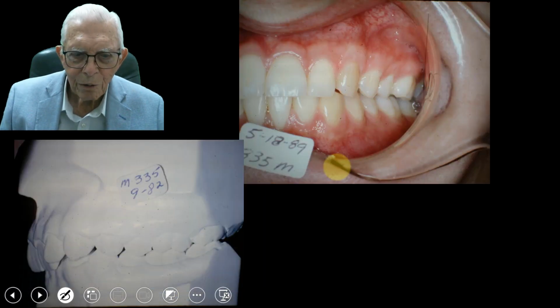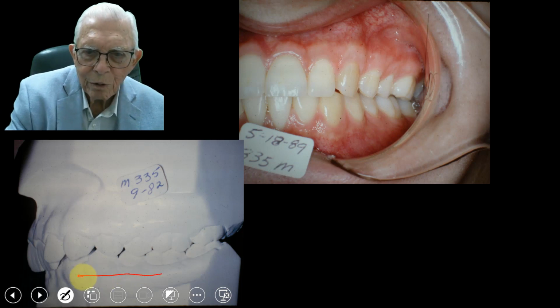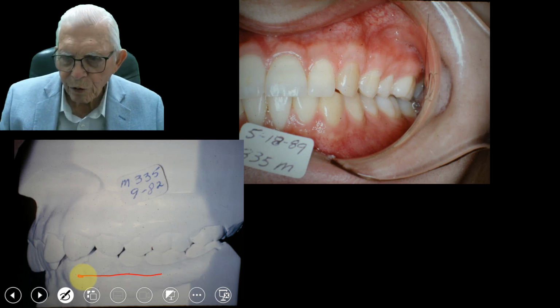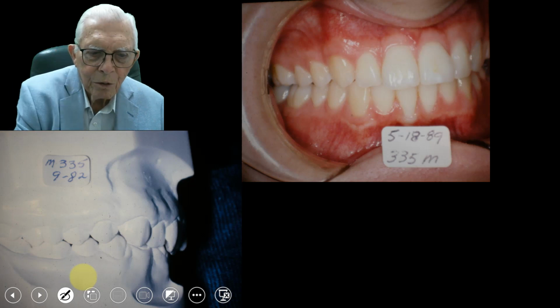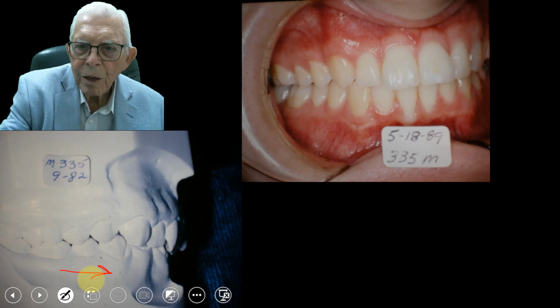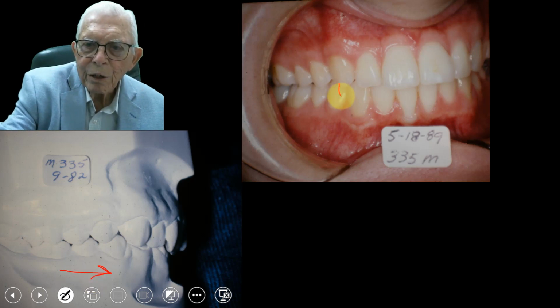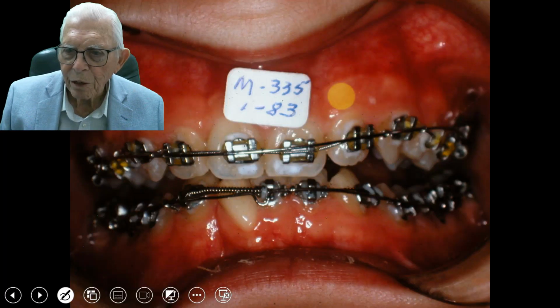And there's another from the other side of the mouth, the finish thing. And you see we brought these teeth out here. So we'll show you how we move the jaw forward and you hold it there, and it'll grow in that position. Now this is another from the other side. Looking at it, you see we're going to bring this out some to fit this jaw. And you can see we got the cuspid and everything lined up. This is the finish part down here in 1989.